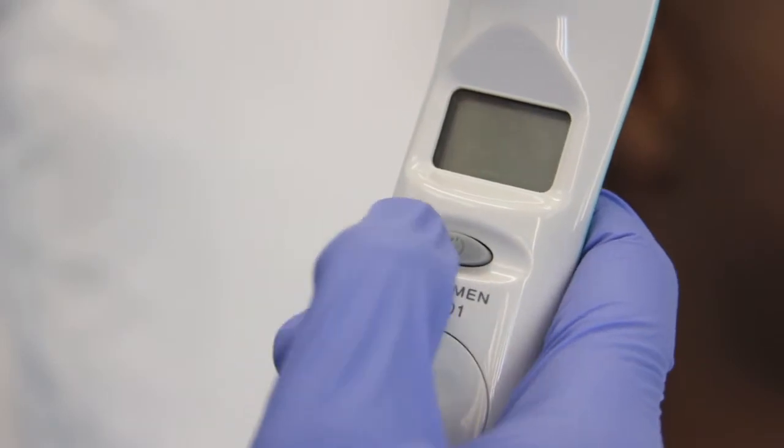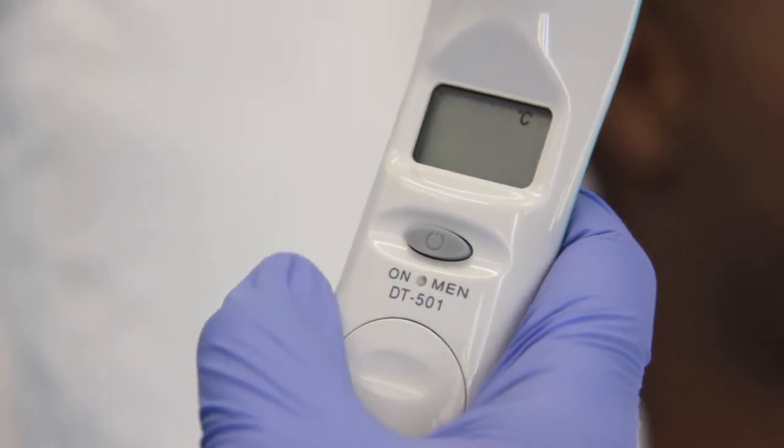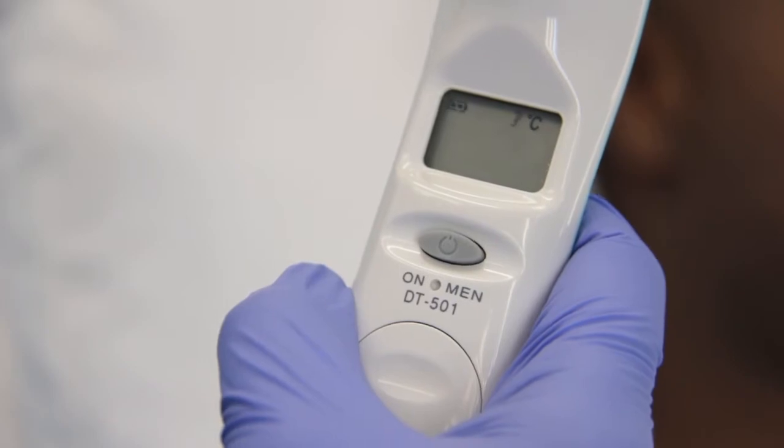Always ensure that the electronic or digital thermometer is in a working condition beforehand. When using an electronic or digital device, always refer to the user's manual and familiarize yourself with the specific device before commencing the procedure.